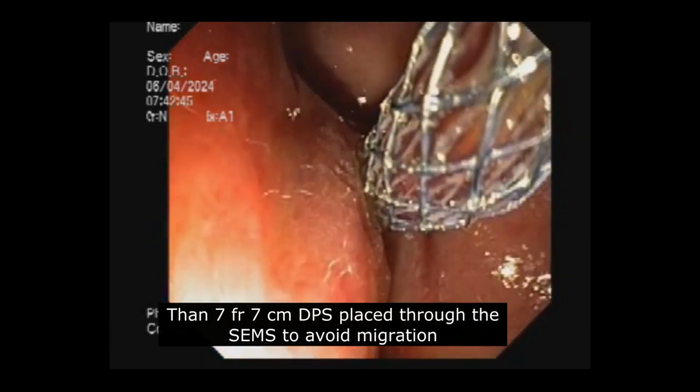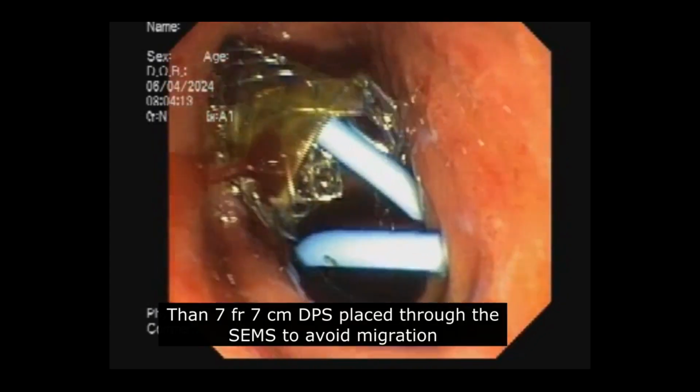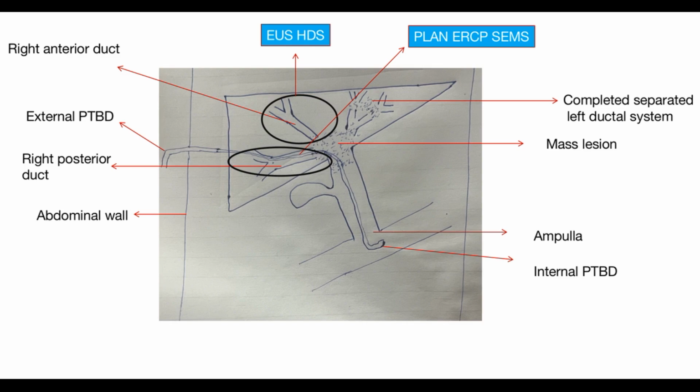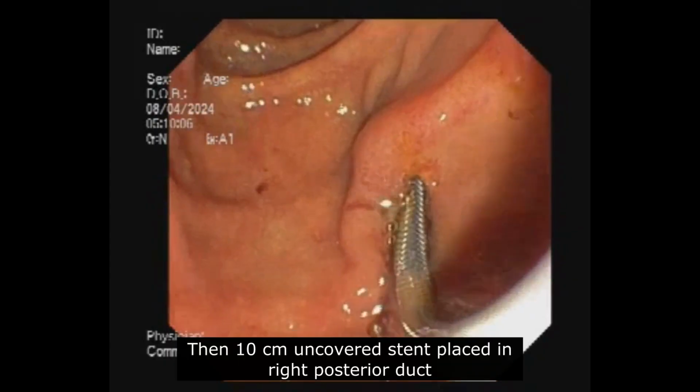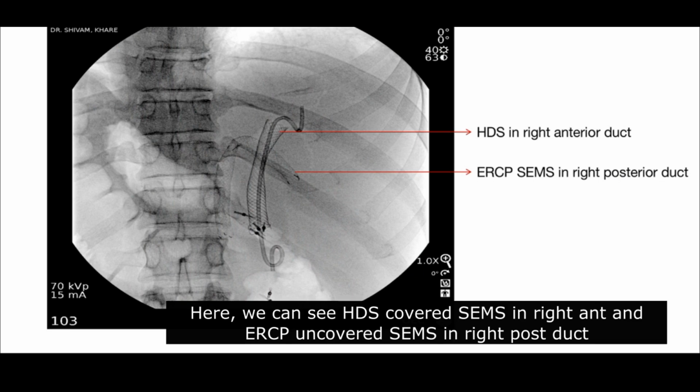Then a 7 French 7 cm double pigtail stent was placed through the SEMS to avoid migration. The next plan was placement of a SEMS in the right posterior duct. So a 10 cm uncovered stent was placed in the right posterior duct. Here we can see the hepaticoduodenostomy covered stent in the right anterior duct and the ERCP uncovered SEMS in the right posterior duct.